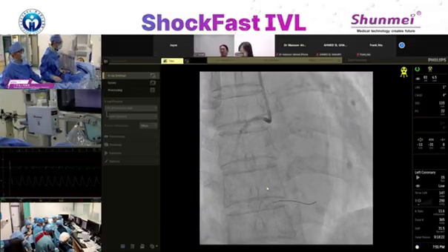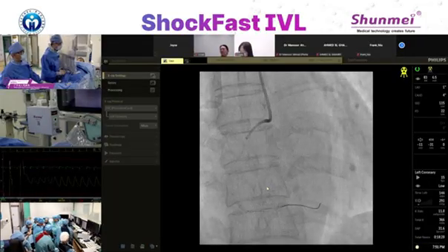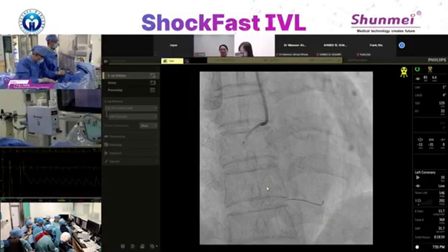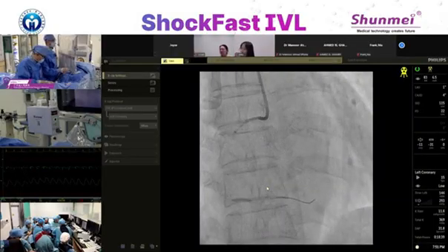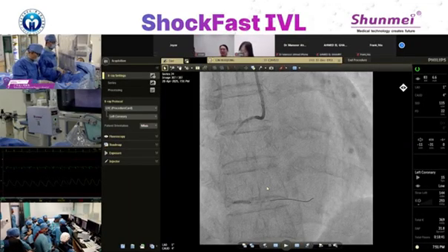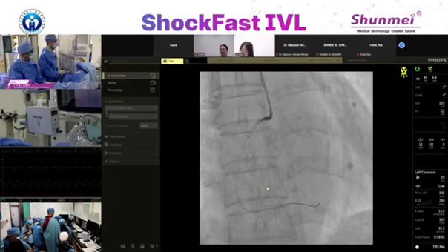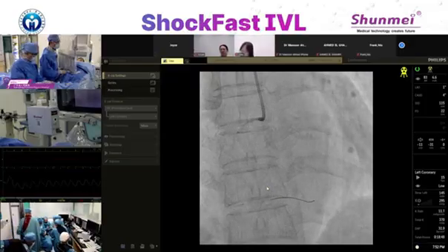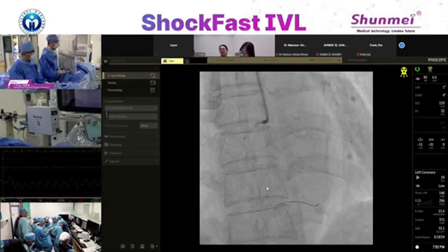Test. Is it here? We passed. I passed. Yeah, here, come on. Inflate. 7, 8, 10. That was a waste, right? Record. Down. Okay, can we get cross again? Yeah, we get cross. Okay, once again, please.